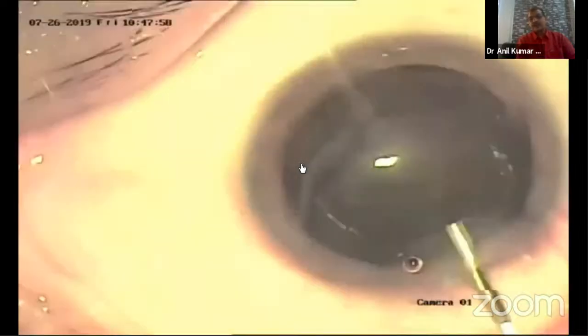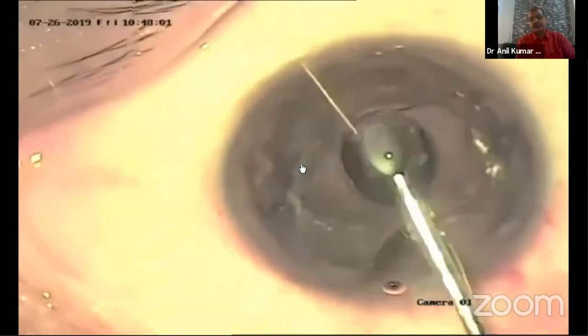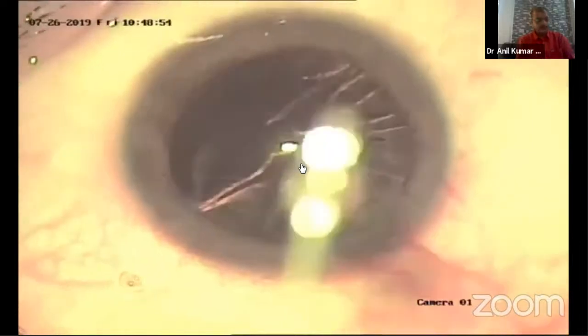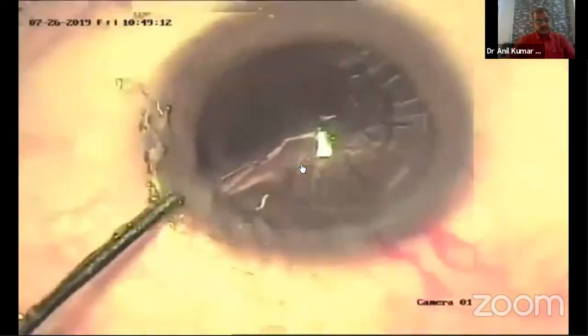For the rest, hydrodissection and hydrodelineation, since he was a 48-year-old male, it was a soft cataract, and we can do it easily. With a regular setup, the nucleus can be easily emulsified, and you can easily aspirate the free cortex. Then the rest is just cleaning of the cortex, a regular phaco, not much of a difference. But the planning of the incision site, the main and side port, the CCC, and the biometry make a difference here.